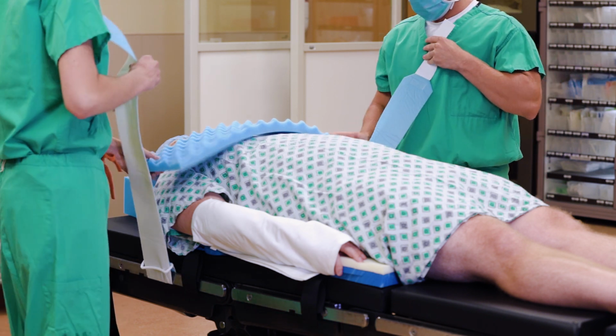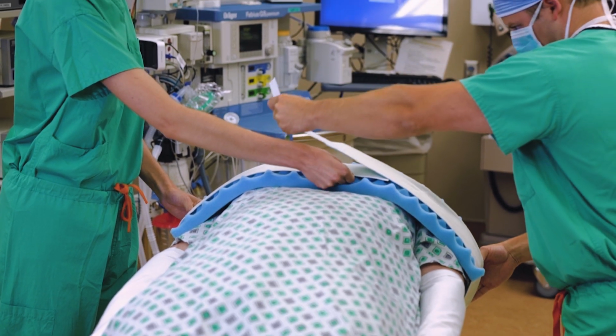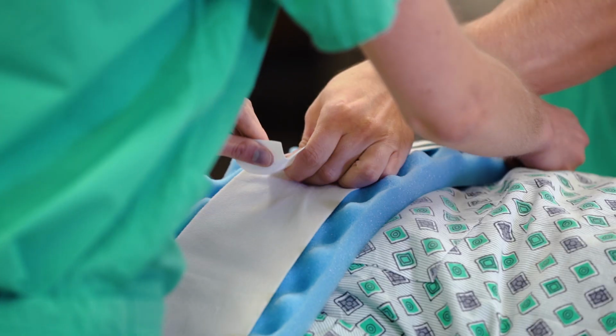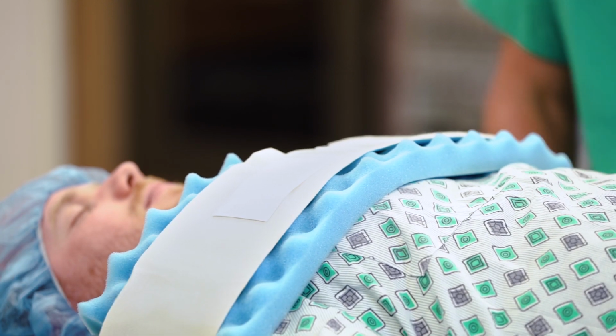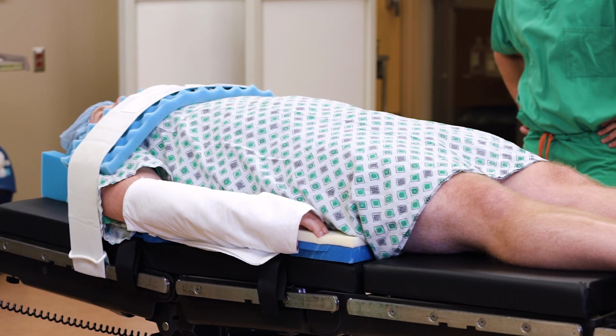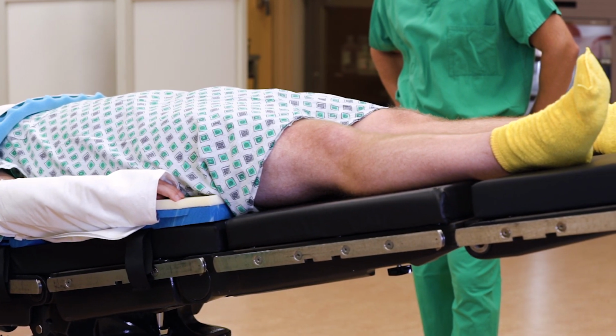The blue side of the strap is now facing the patient. The strap is secured and placed over the blue foam. Bring the hook part of the second strap over the patient and the chest foam to secure closure. Once secured to the pad, you can place the patient in the Trendelenburg position.